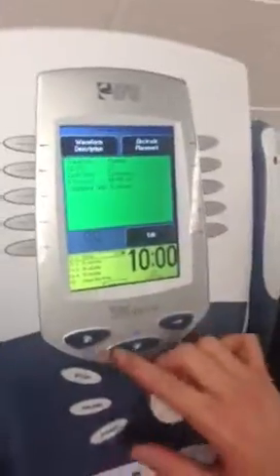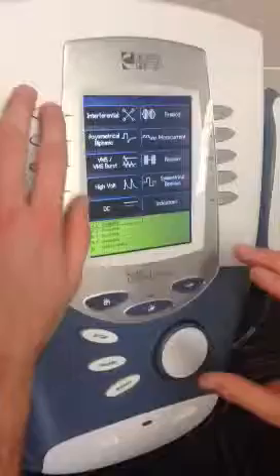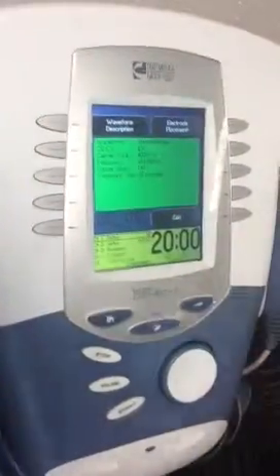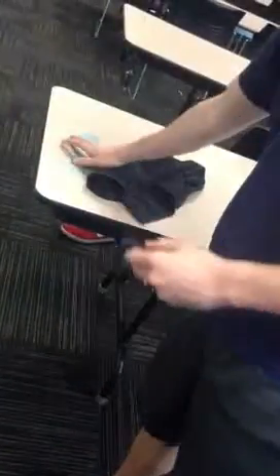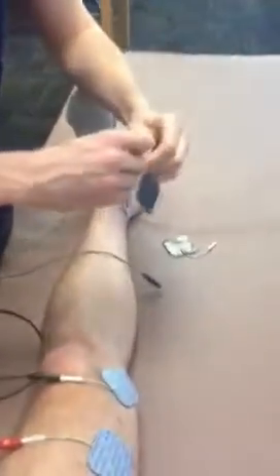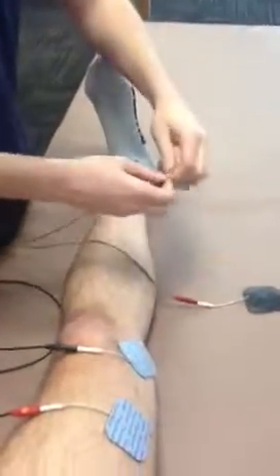So from here, I would just go to start new treatment. Actually, I could just go home. Go back into electrotherapy. Because we just did premod, now we're going to do interferential. And this requires 4 pads. It's basically doing the same thing with these, connecting the red and black wires.